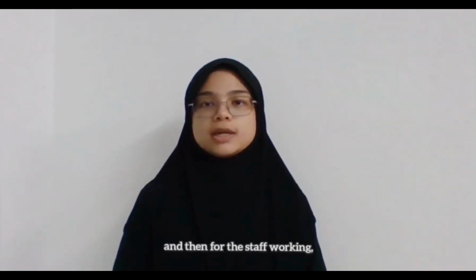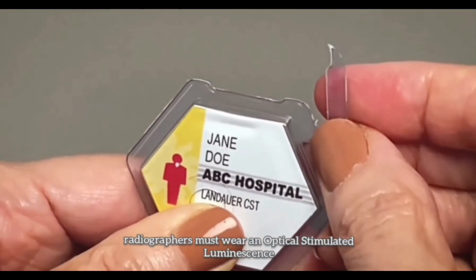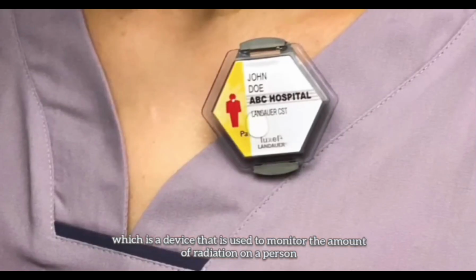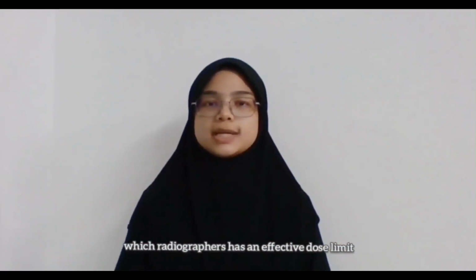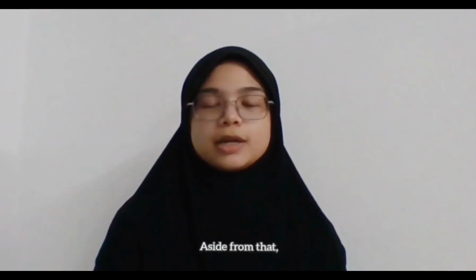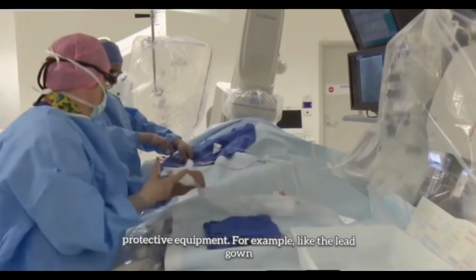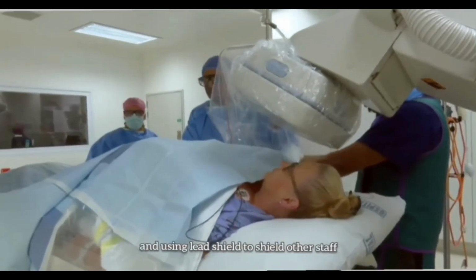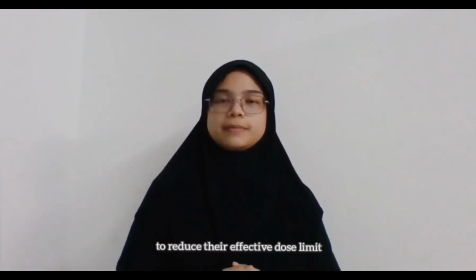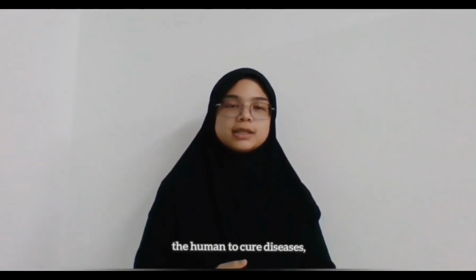And then for the staff working, rules have provided that radiographers must wear an optically stimulated luminescence dosimeter, also known as OSL, which is a device used to monitor the amount of radiation received by a person, and radiographers have an effective dose limit of 20 millisieverts every year. Aside from that, radiographers are provided with protective equipment, for example the lead gown for all staff during angiography, and lead shields to shield other staff during mobile X-rays to reduce their effective dose.